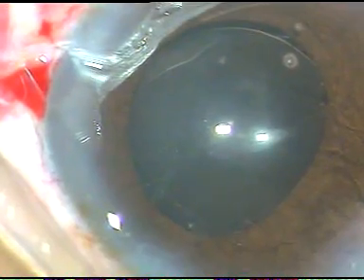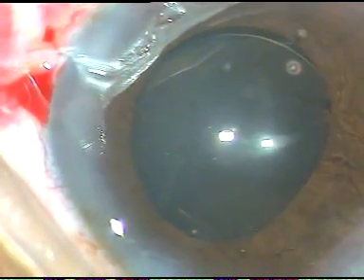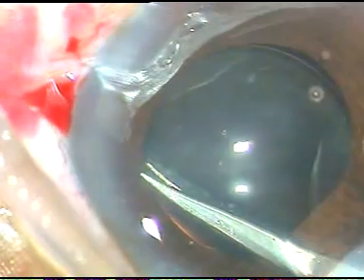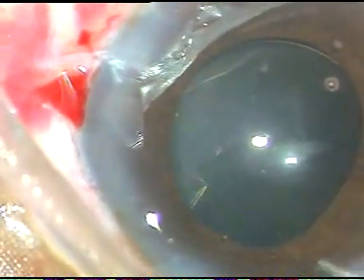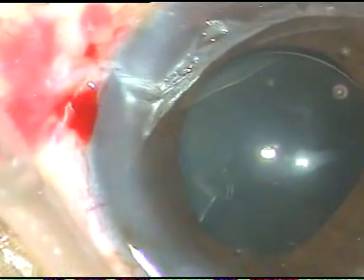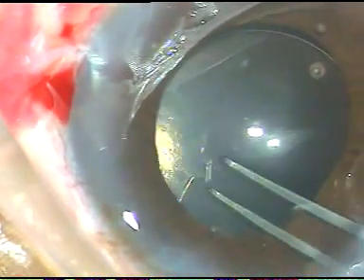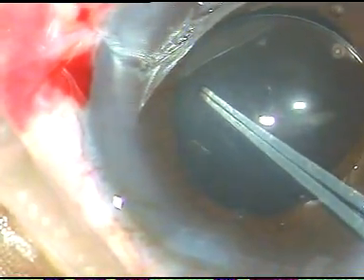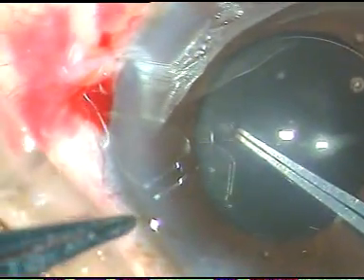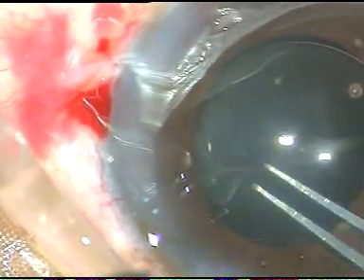Now I want to remove a portion of the anterior capsule which is from 1 o'clock to 4 o'clock. There is a large flap. Now see what happens. When I pull this capsule, the whole thing tends to come. So I cannot pull it like that.